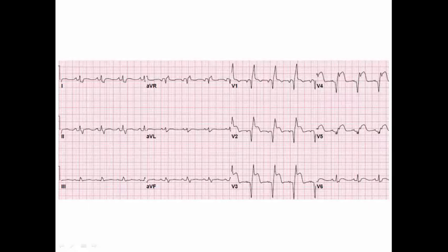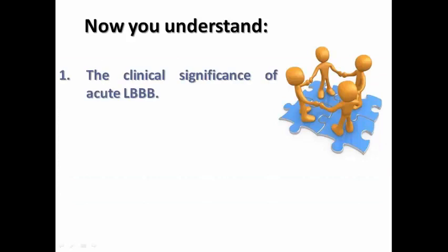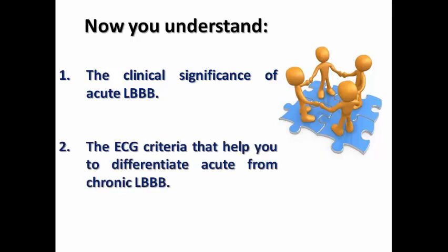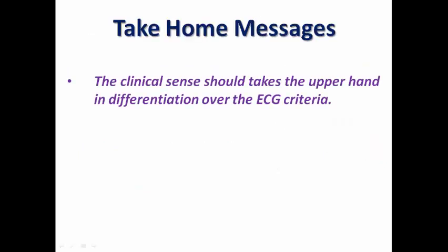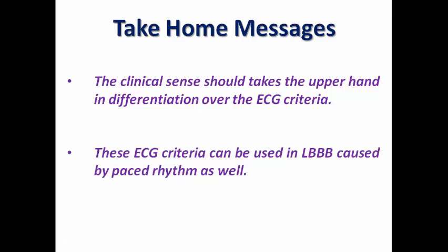In another example, we can see ST-elevation in V1-V4 and V5, extensive anterior STEMI with formation of pathological Q waves, but also a prominent R wave suggestive of right bundle branch block morphology. This patient has extensive anterior STEMI with acute right bundle branch block — a very high-risk sign requiring a rush to the cath lab. In summary today, we understood the clinical significance of acute left bundle branch block, the ECG criteria to differentiate acute from chronic LBBB, and our take-home message is that clinical sense should take the upper hand over ECG criteria, while these ECG criteria also apply to paced rhythm.